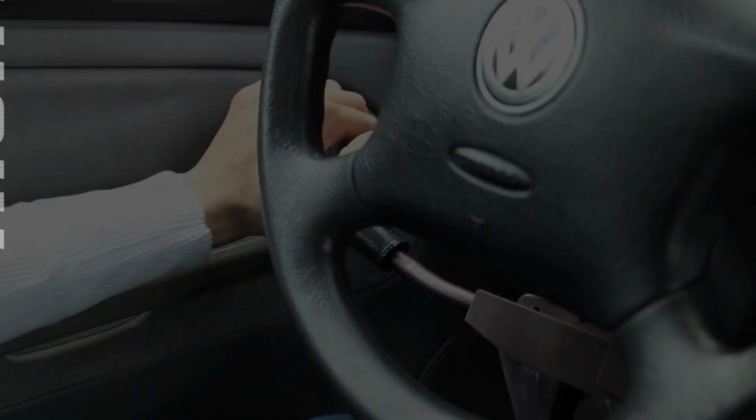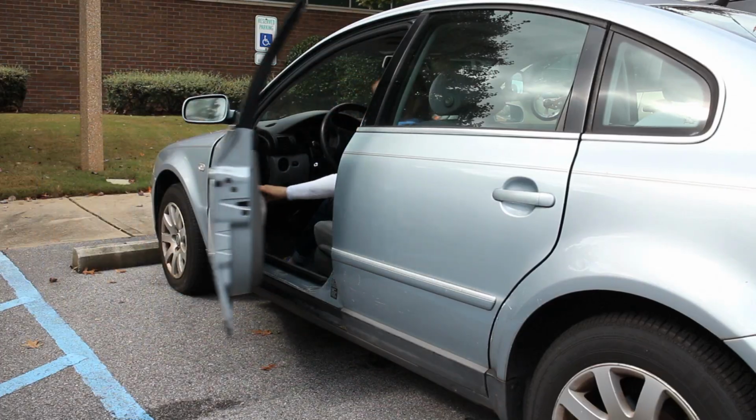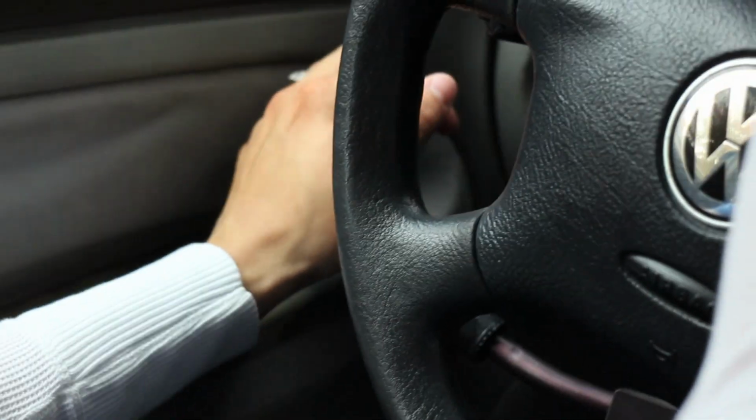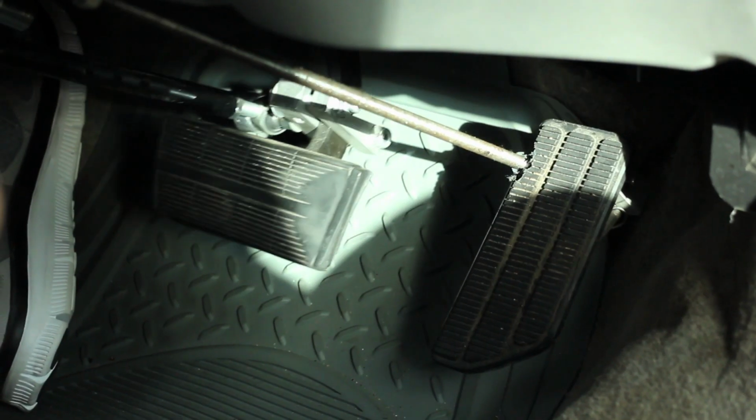The standard or mechanical hand controls come in three main styles: push-pull, right angle, and motorcycle. All styles of hand controls have their pros and cons, so your decision will be largely based on personal preference. I drive with right angle hand controls, where I must press down to accelerate and forward to stop. But I also have used push-pull controls.